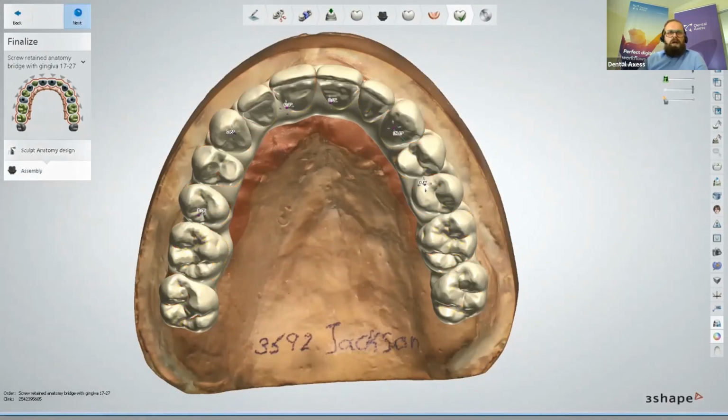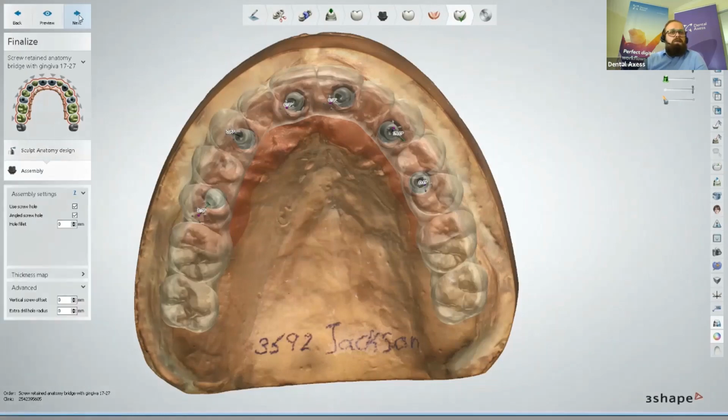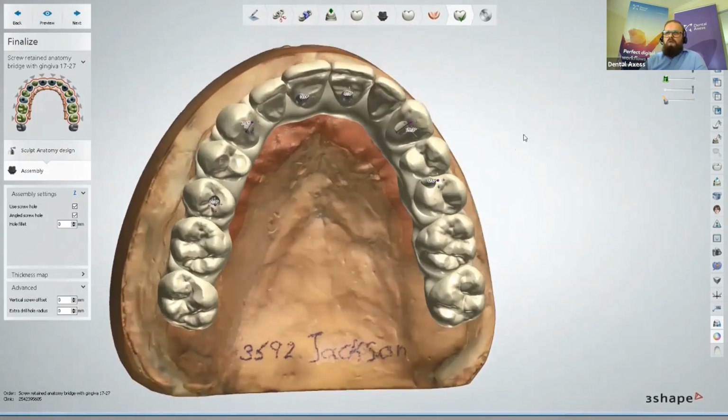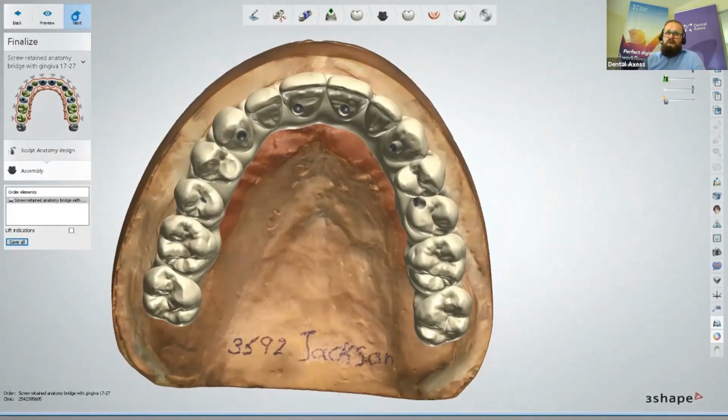And then we go into the assembly. Assembly is again the implant position, or basically the angled screw hole. If we need to change them, we can change them here. Not every implant can do that technically, but a lot of libraries allow it, so you also have the warranty from the manufacturer. If you do that, it doesn't give an issue. Here you can change them. It really depends, but most of them go between 15 and 28 degrees.